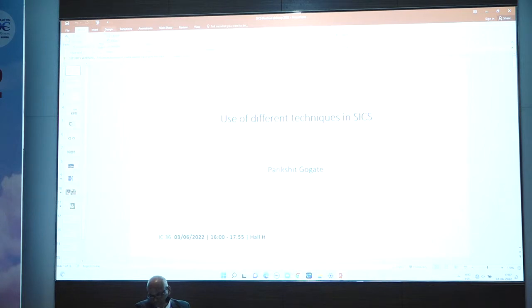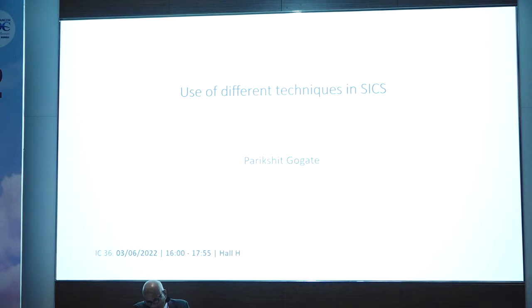But as everybody who has done both phaco and SICS knows, in many ways SICS needs more skill to do than phacoemulsification. But there are various places where manual SICS is as good or perhaps even superior to phacoemulsification. Hard cataracts, brown cataracts, many kinds of subluxated lenses, places where corneas are not very good, that is very old patients or patients with Fuchs endothelial dystrophy, the SICS is much, much better.